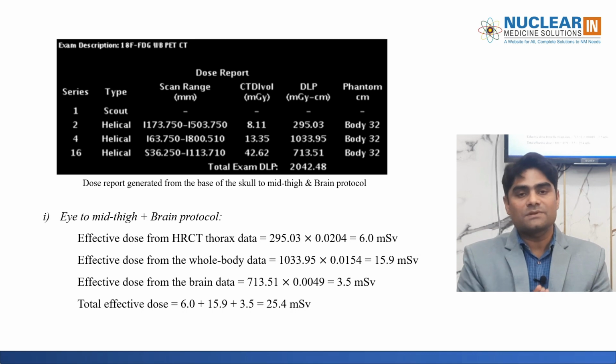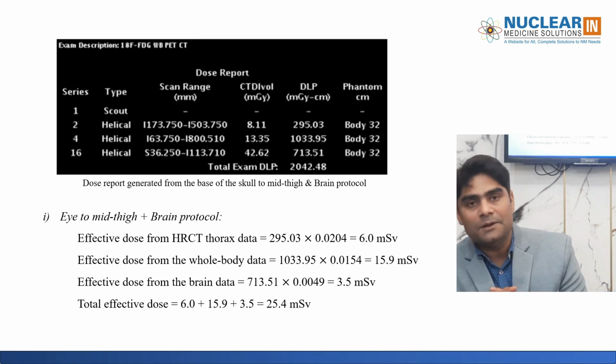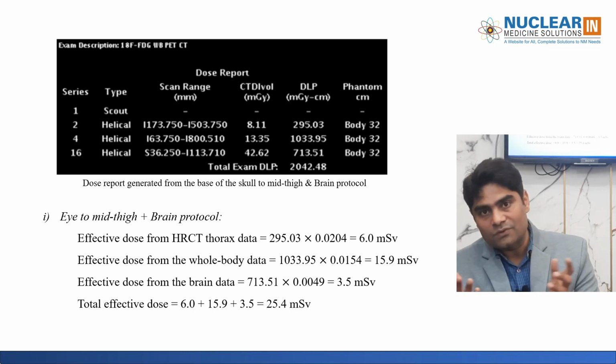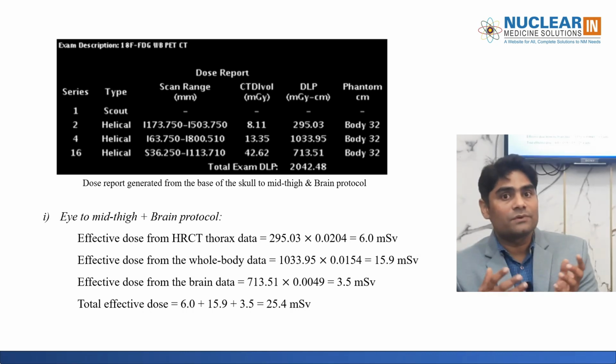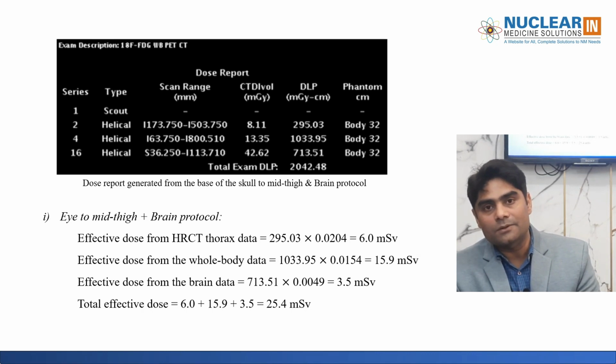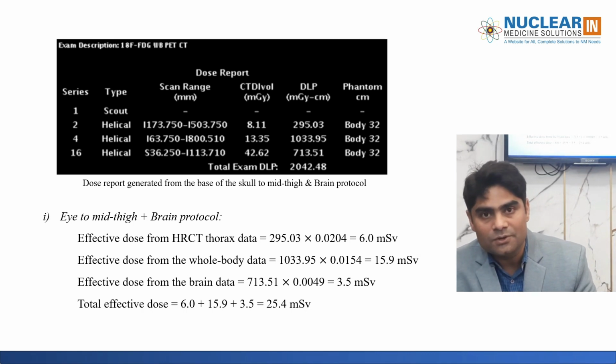But why is this difference there? Because the same length of patient was scanned, but certain areas get overlapped between these two protocols, so we are getting more dose. So we should be careful while deciding which protocol should be used for which patient.